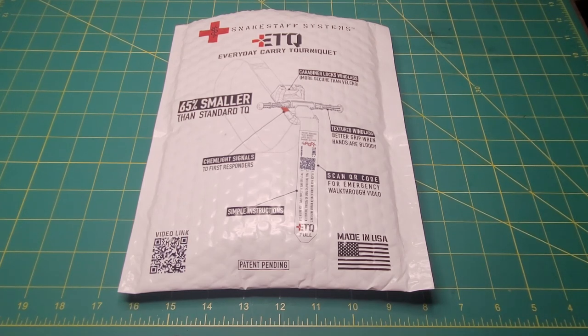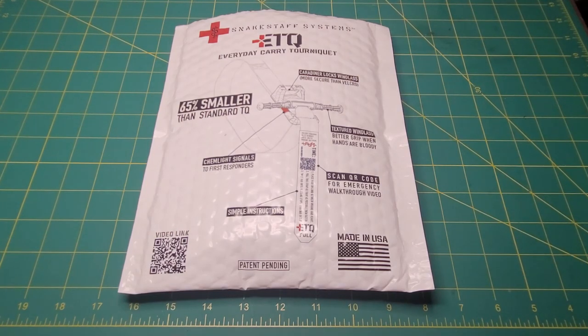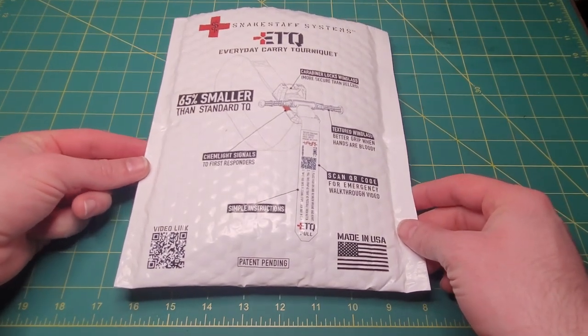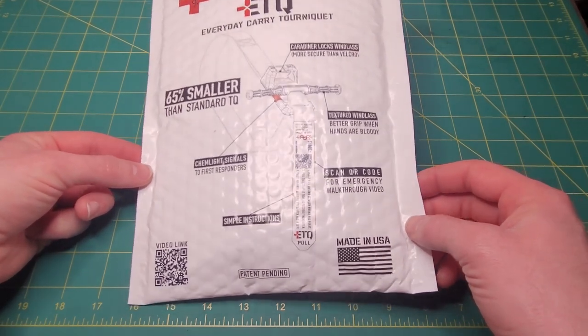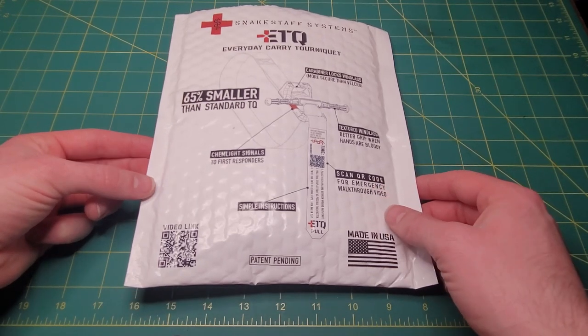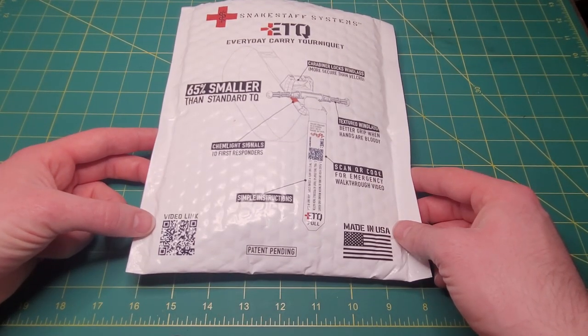Welcome back everybody. I've got a pretty cool exciting unboxing and first look today. I ordered an ETQ everyday carry tourniquet from Snake Staff Systems. I got it in the mail today — ordered it about a week ago. This is the packaging it came in. Kind of cool, they've got their custom envelope with the tourniquet on it, some of the features listed, and a QR code that takes you to their video on how to use it.